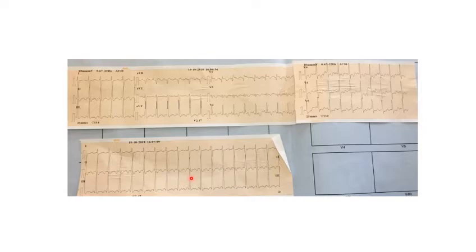Okay, sir. In this QR pattern in V1, PH, we should also consider a systemic PH. I thought it was a small R. Okay, sir. Yes, sir. You can. Yes. Okay, next one.